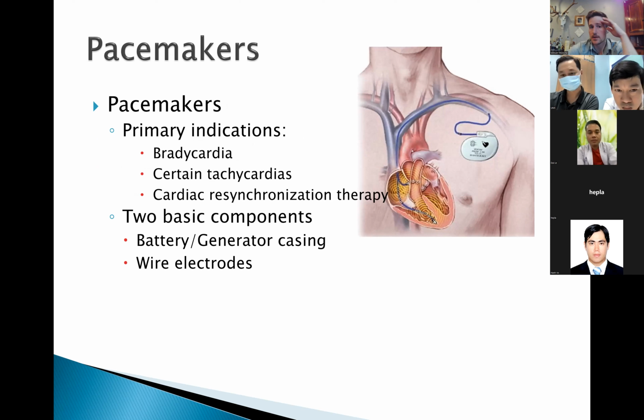So pacemakers, our indications for these are bradycardia, certain tachycardias, and then something called cardiac resynchronization therapy for patients that have congestive heart failure and a bundle branch block. So there's two basic components. We have a battery generator and then the casing. So many of these patients, right, you can just feel their pacer subcutaneously. And then we have the wire electrodes.